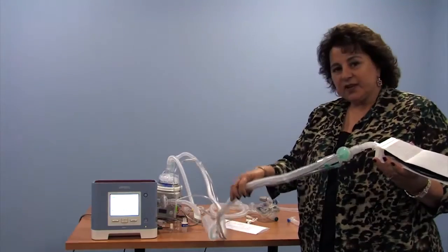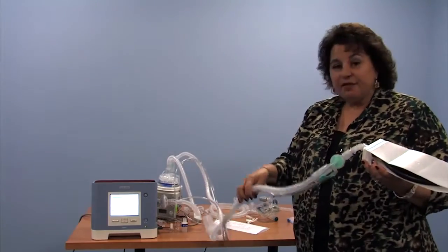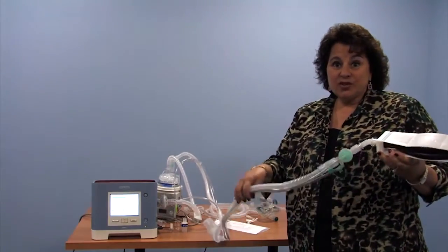What you may notice is that when water builds up, the tubing starts to move. And when the tubing starts to move, it can falsely tell the ventilator that your child wants a breath. At some point in time, your child is resting comfortably and you notice that the respiratory rate on the ventilator seems to be quite high. And you do look at your child and the chest is going up and down. But you look again and see the tubing moving. The tubing will cause false initiations of breaths from the ventilator if there's quite a bit of water there.